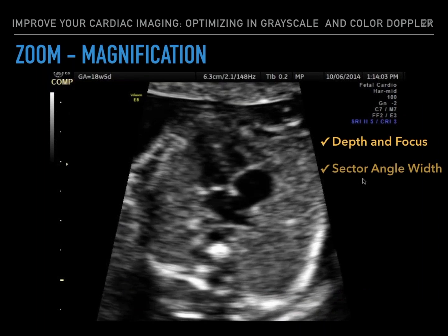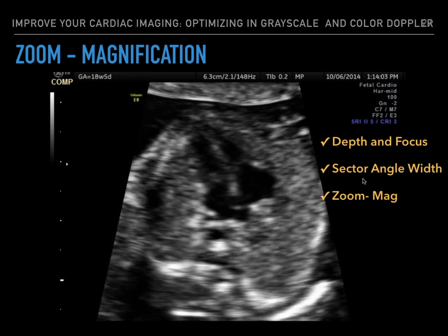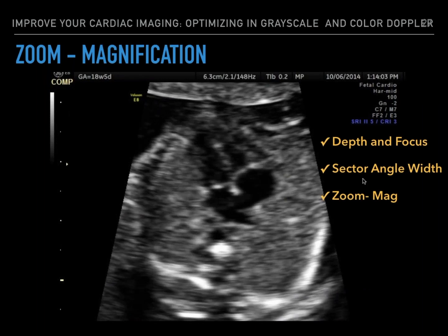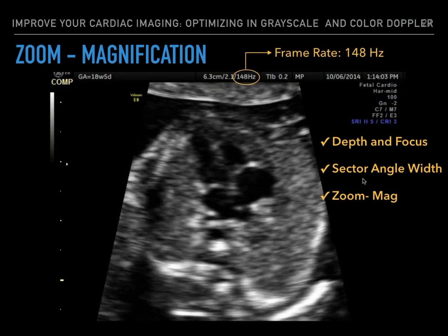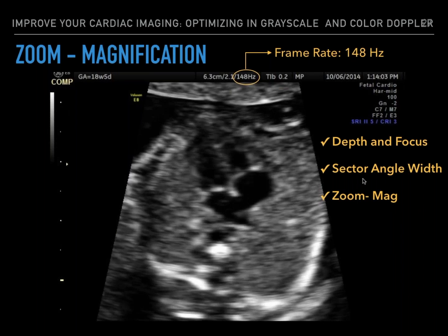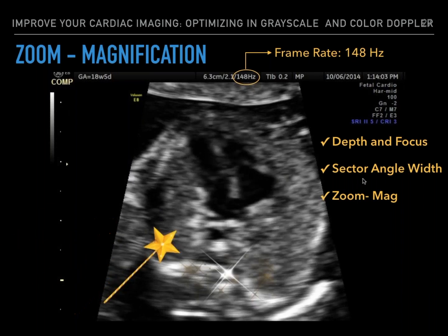So after applying all these steps, we can see the heart clearly, and temporal resolution is at its best with an increased frame rate of 148 Hertz, which is great. But wait, there is still more that we can do. We can actually enhance our image.